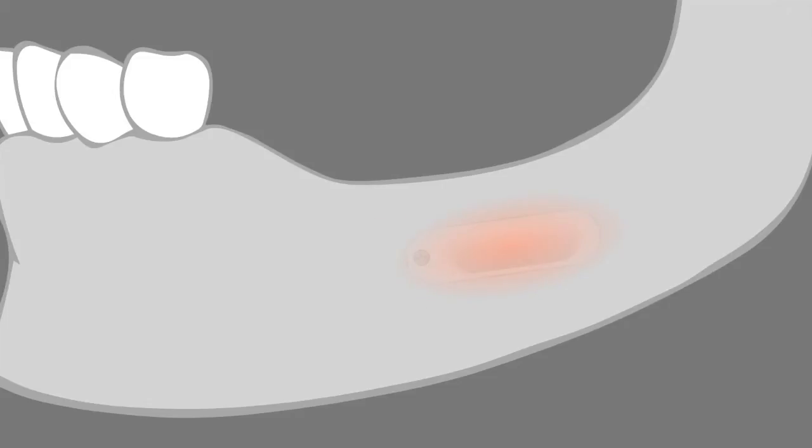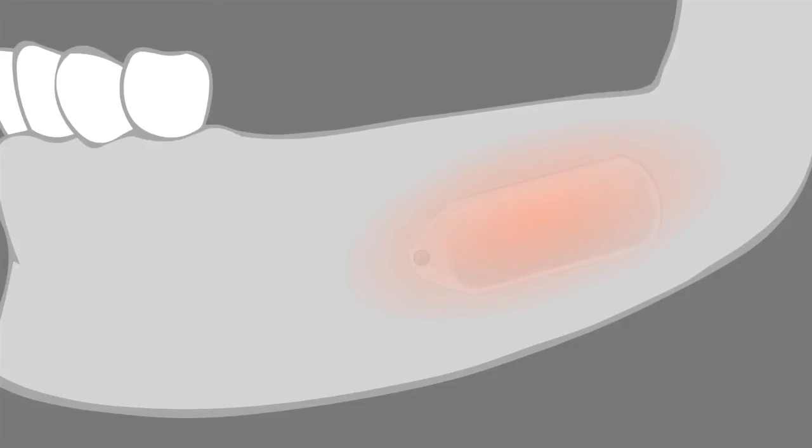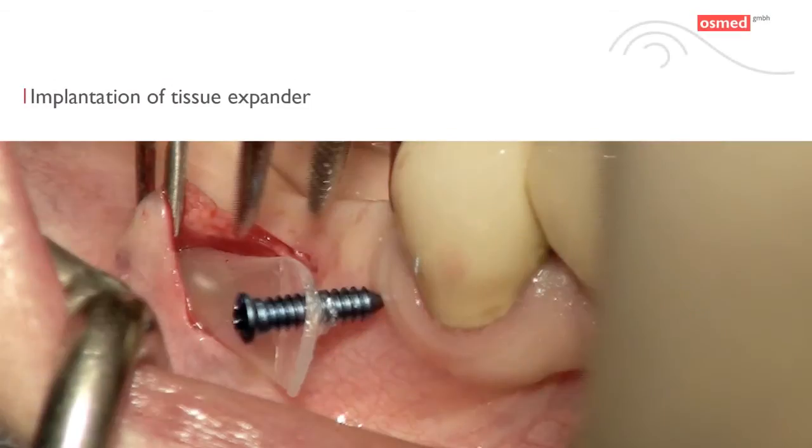Usually tissue expansion and maturation are completed after 6 to 8 weeks. The expander is removed in the course of augmentation surgery. Incision and flap design are chosen as required for the intended method of bone augmentation. It is possible to cut directly into the expander. Implantation of tissue expander.